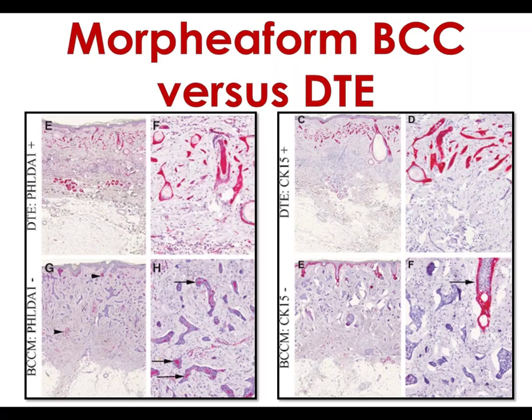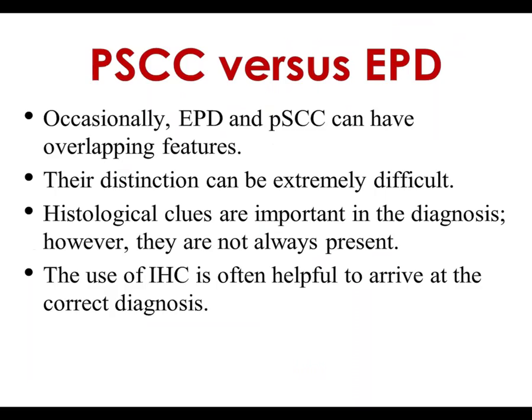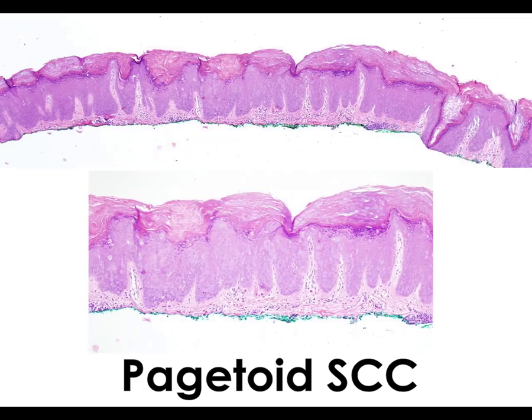Now changing topics — this is another very common problem encountered in dermatopathology almost every day: pagetoid Bowen's disease or pagetoid squamous cell carcinoma in situ versus extramammary Paget's disease. Both entities can show overlapping features and depending on the clinical context it can be quite challenging to make a diagnosis on plain H&E alone. Immunohistochemistry is very useful here. Here we have an example of pagetoid squamous cell carcinoma in situ — look at the full thickness of epidermis and the single cells. If you see this in a sun-exposed area, you just call it squamous cell carcinoma in situ.